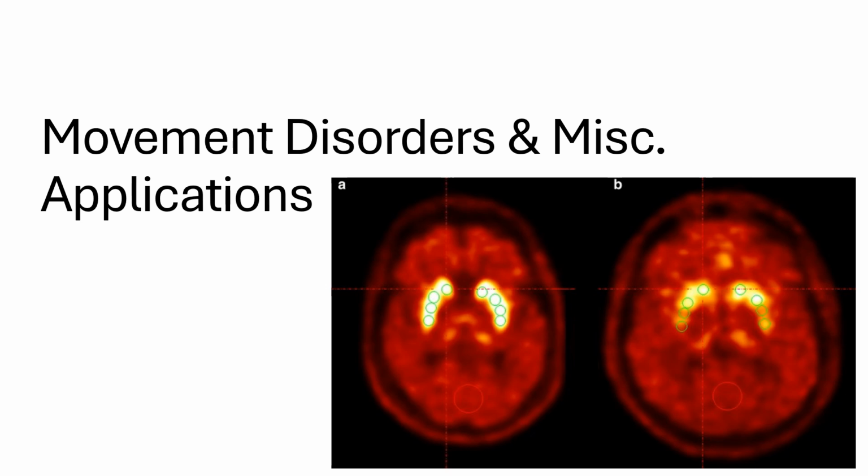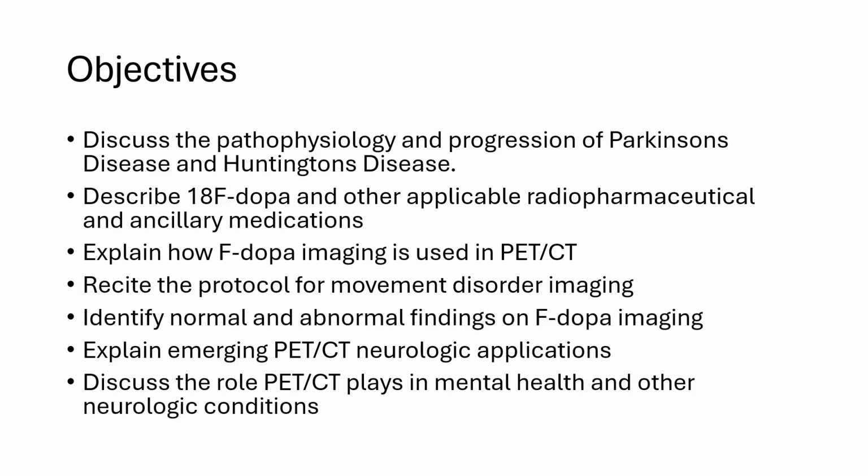Welcome to this lecture on PET neurology imaging for movement disorders and miscellaneous applications of PET neurology. These are the objectives for this talk.